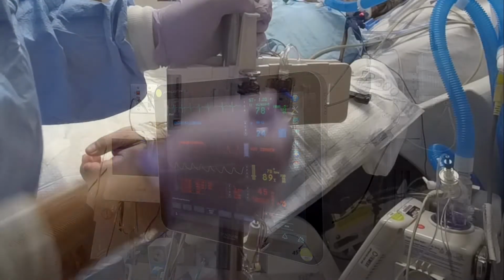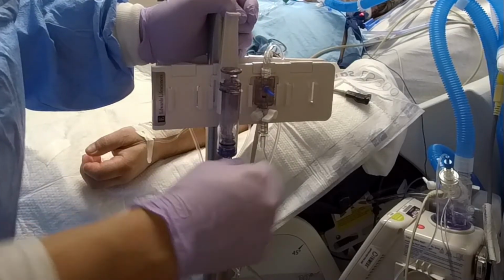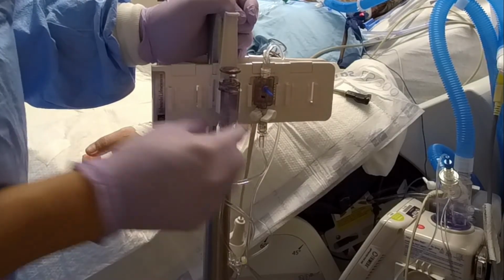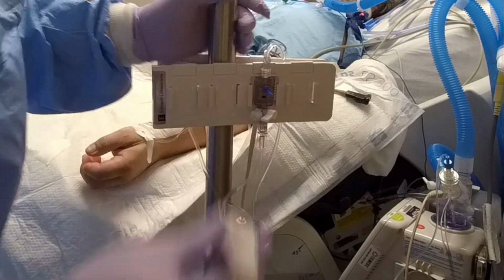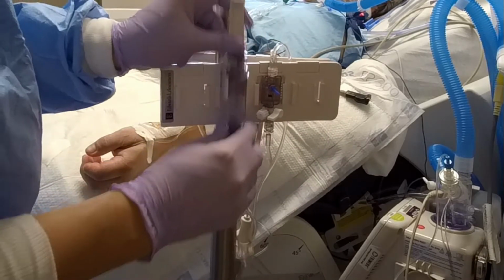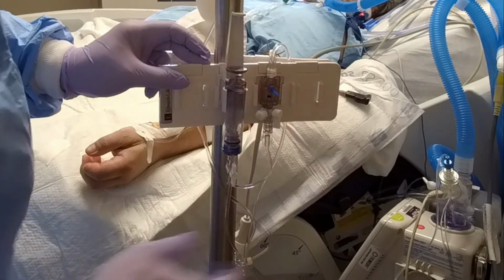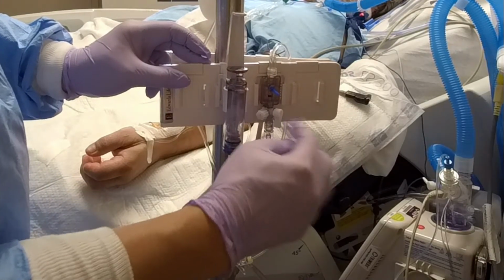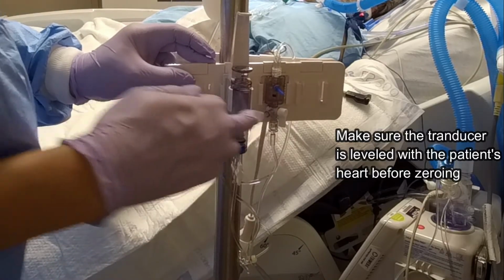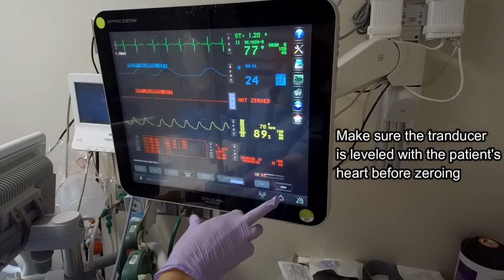Alright, here, we're gonna zero the monitor. So here's a transducer. You want to close this off to the patient. Always, and the patient is always the syringe. Okay. So follow the line to the syringe and close it off. So closing off is wherever this is pointing, let's close. So you're gonna open this to room air, alright? And then let's go to the monitor. You're gonna come down here and press zero.